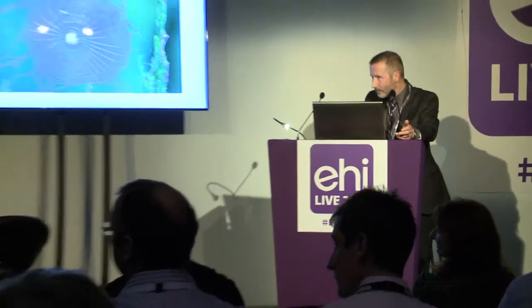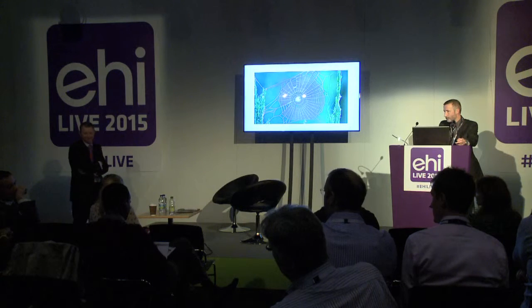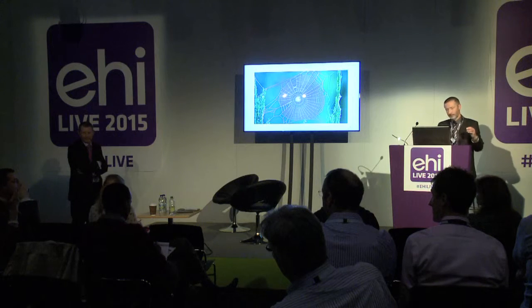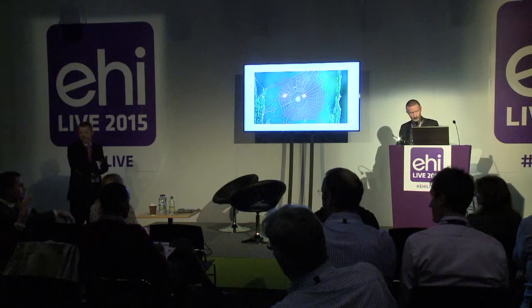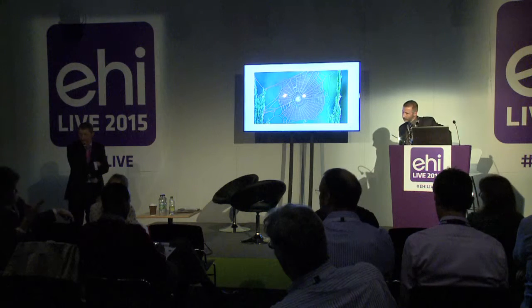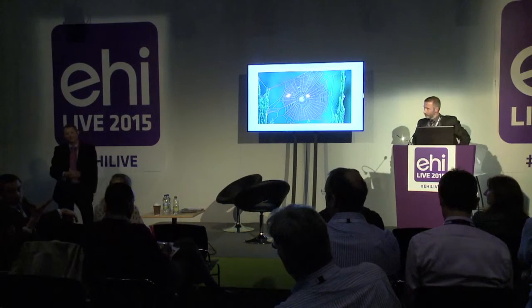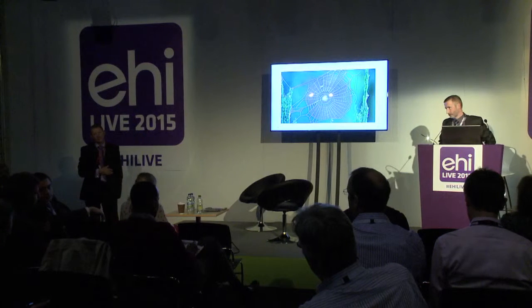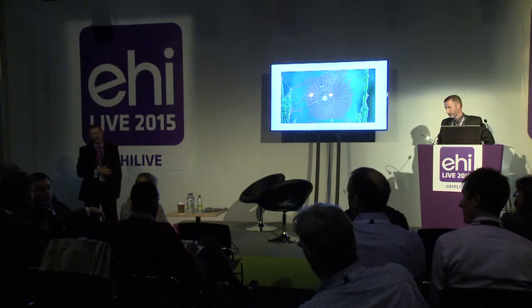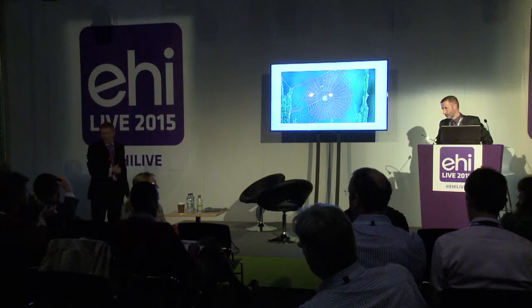I just wanted to ask a couple of very practical things that I don't completely understand. At the level of the histopathologist with his glass slides, for us in imaging, it's easy in a way in that the radiographer takes the images and acquires them, and the entire study goes onto our PACS, and we have no say over it particularly. We could ask for more views to be done or reconstructions to be sent and that sort of thing, but that's modifying data that are already acquired digitally.